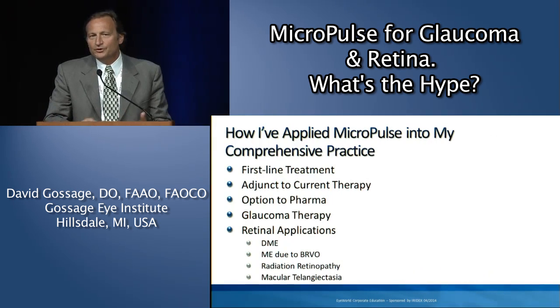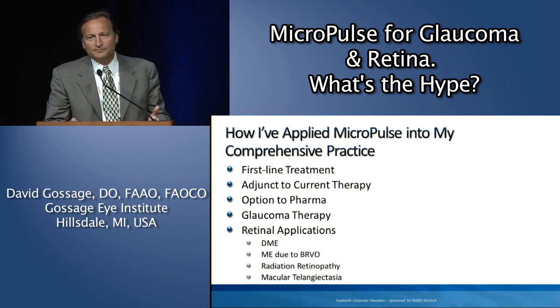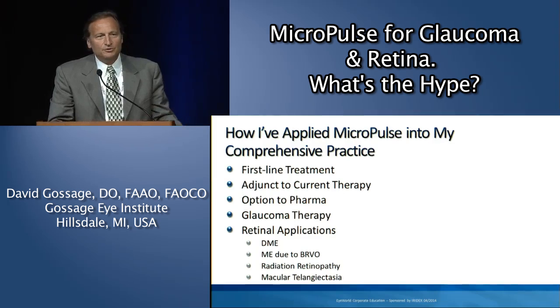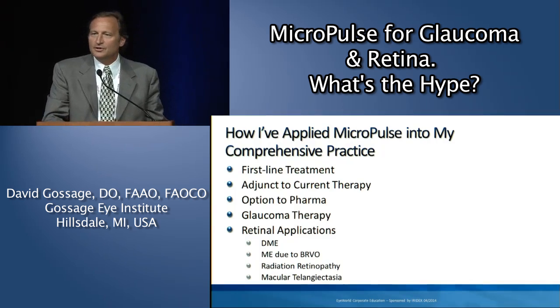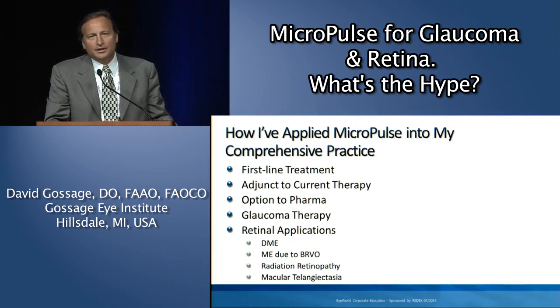So really, I've incorporated the MicroPulse into my practice as a first-line treatment. Remember, we talked about using it for glaucoma, and so from my standpoint, I do offer it to the patients. We have the opportunity to use medications and/or laser. And early on, when people were starting to use laser for the treatment of glaucoma, patients were a little skeptical. They didn't know if they wanted to have the laser done.